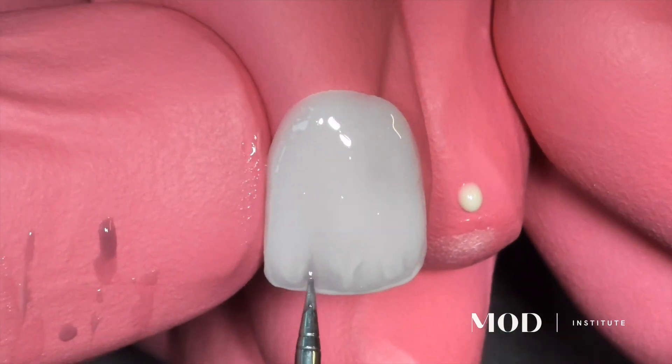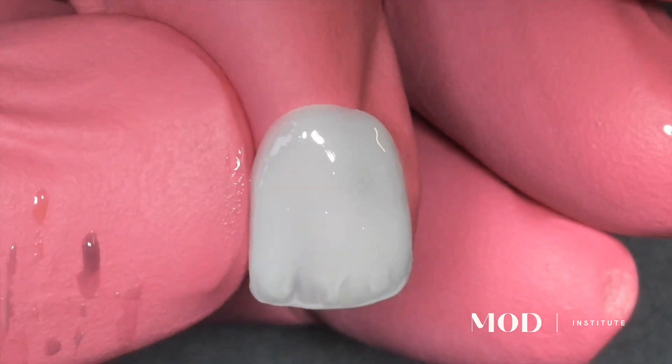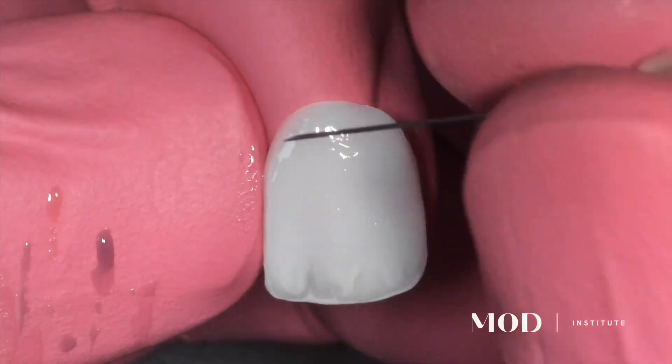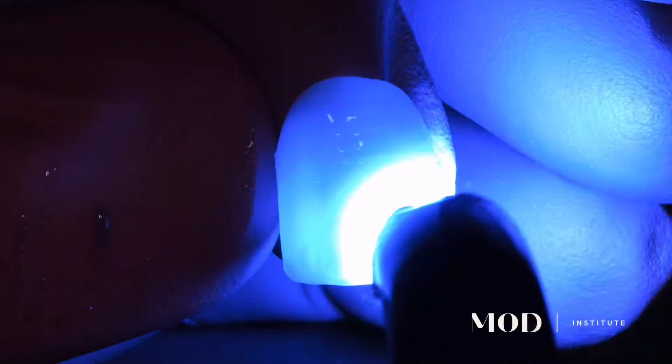The nice differentiator here is this could be used in the mouth, whereas you can't really use wet liquid print resins in the mouth. In addition, it's viscous enough that you could add micro texture with a little needle. And the beauty is you could cure it with a regular curing light — you don't have to put it into a box cure unit.